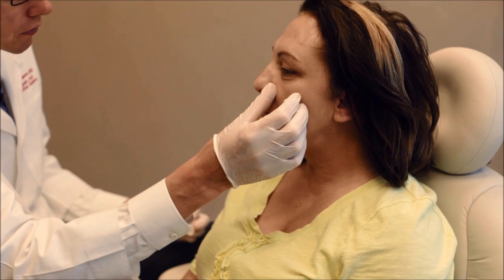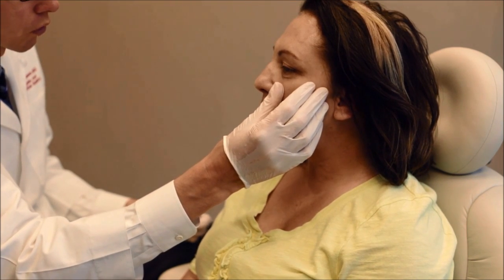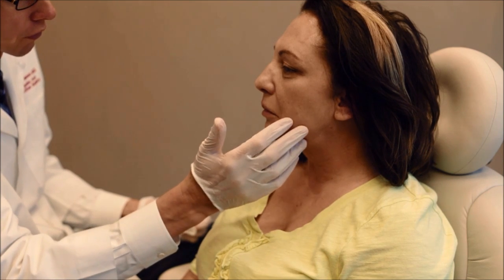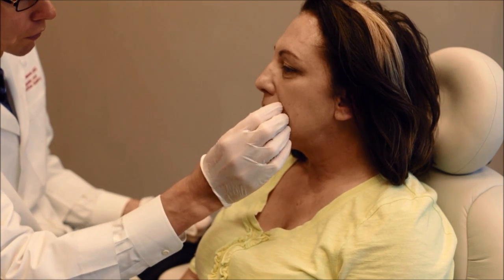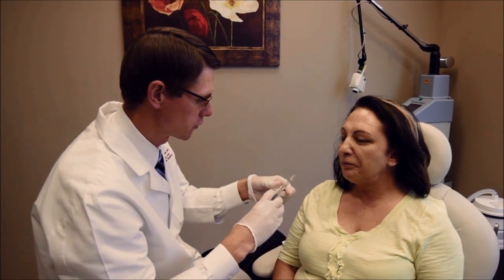Okay, Lisa. We have Lisa here. We're going to do some filler today. Lisa has a facial nerve injury that's been for quite a while, and we've done some different Botox and fillers for her. But today, we're going to put some filler in the nasolabial folds to soften them up a little bit. And this filler is Juvederm.